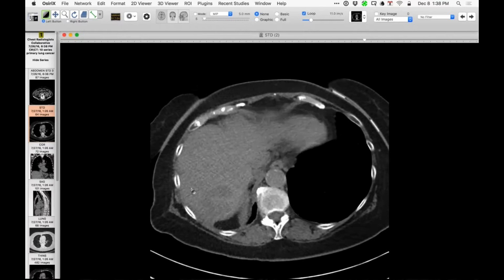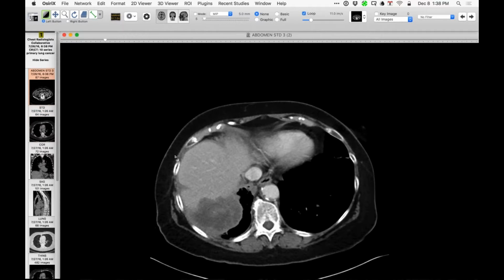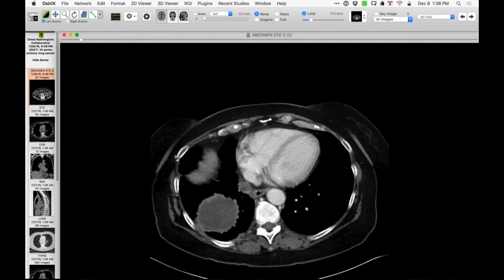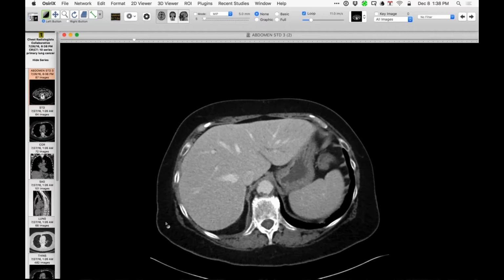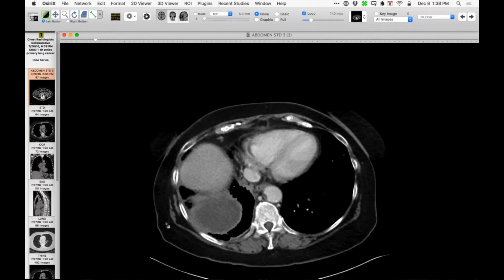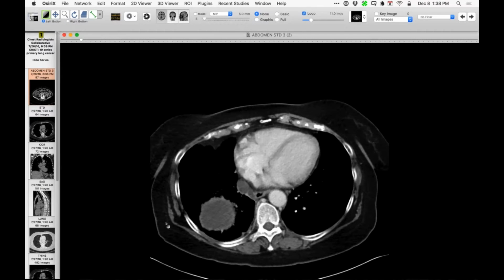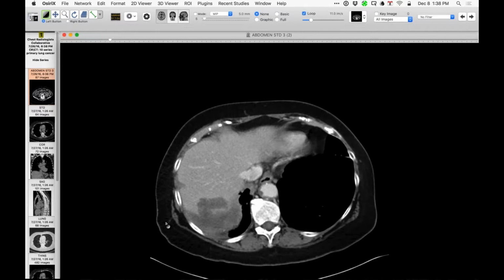chest, you can see there's something wrong here. Abdomen, this is with contrast. So you can see she's got a process that involves the lower chest and this. And you can see that the liver is really involved too. So there's intrahepatic parenchymal, but also basal chest. And I think the initial diagnosis was thought to be an infection. I'm not sure exactly what it clinical.